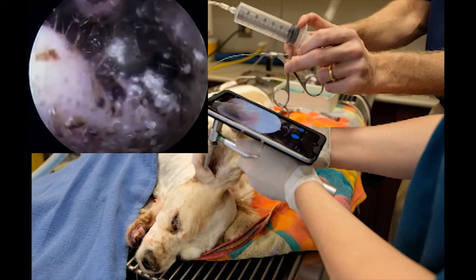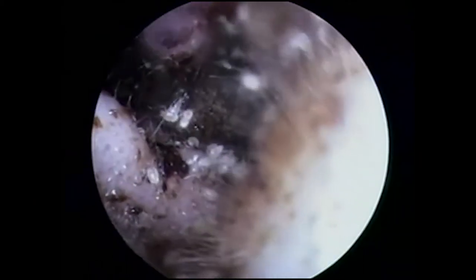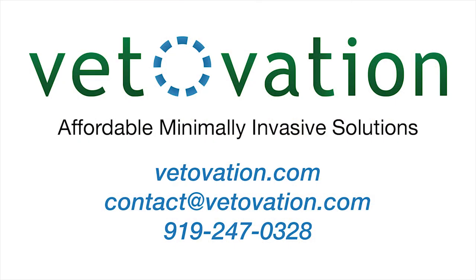You can also attach an IV bag or syringe to flush fluids through the introducing port on the scope, and a grasper can be used at the same time. Images and videos are easily shared with the client via email. This system can also be used with other scopes to perform rhinoscopy and rabbit intubation. Feel free to contact VetOvation at 919-247-0328.